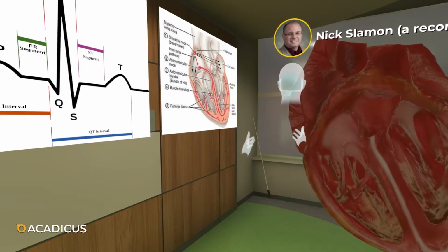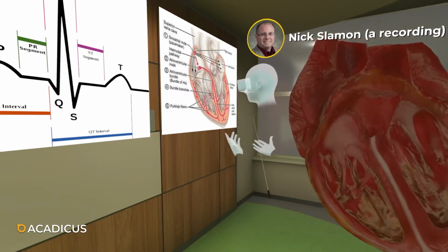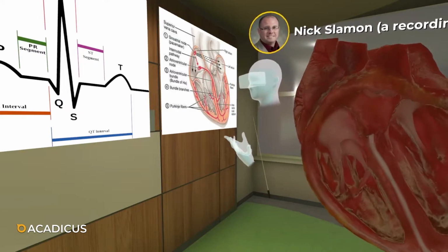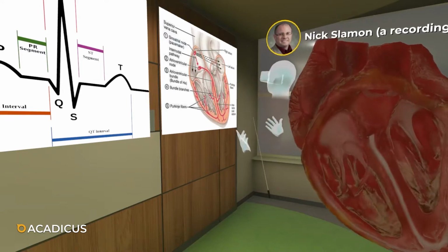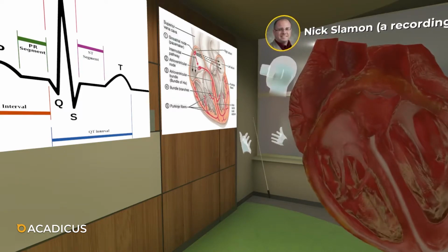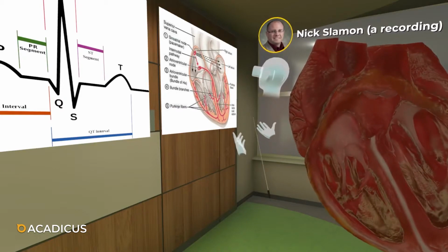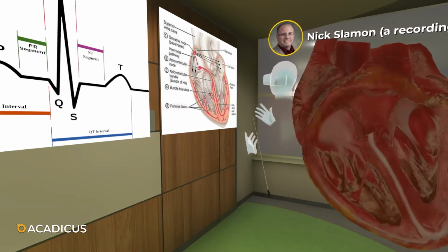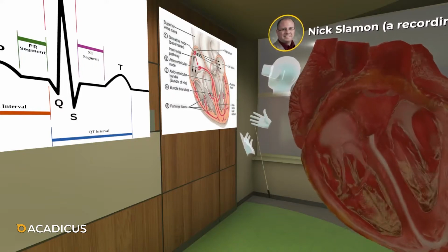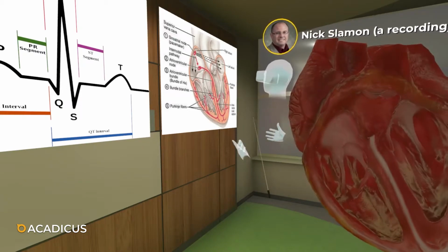What we want to have a concept of, or what we want you to start thinking about, is electricity moving through wires, whether it be telephone or coaxial cable for your cable television, or it's always more efficient to move through some kind of electrical conducting system. And the heart has that built in. So that initial cell, that pacemaker, that SA node, starts the electrical charge, but then it starts to conduct through this embedded wire system through the heart. So the SA node beat travels down the atrium to the AV node, shown here in number 2.